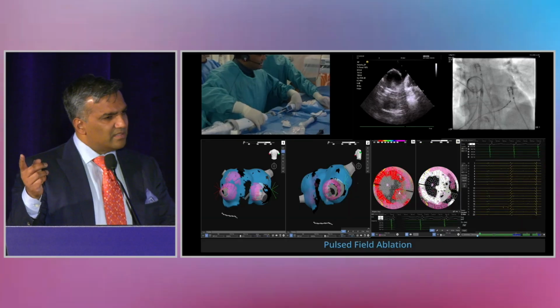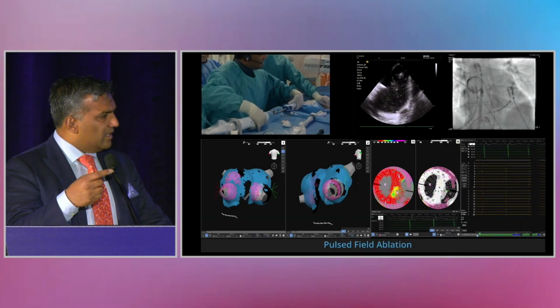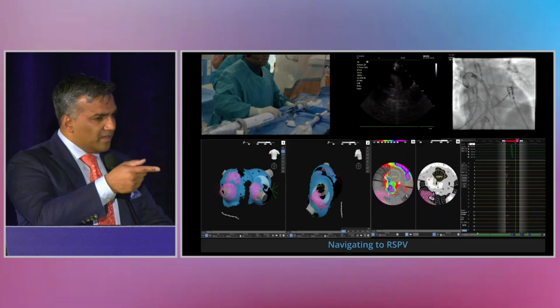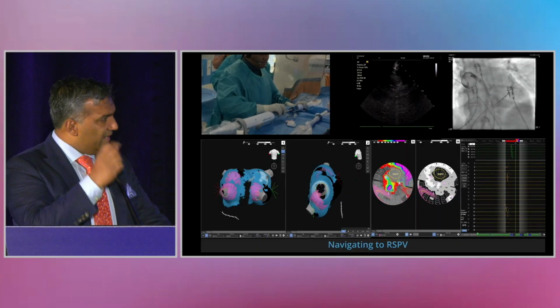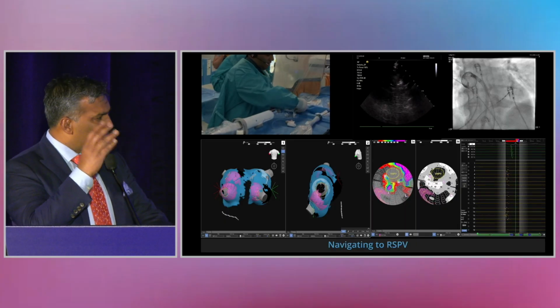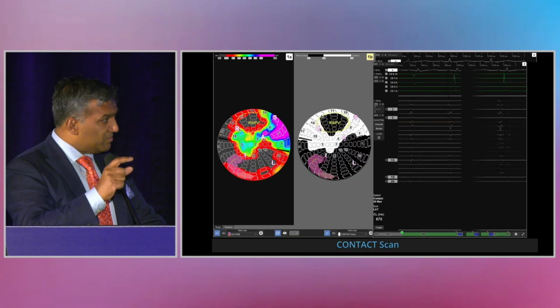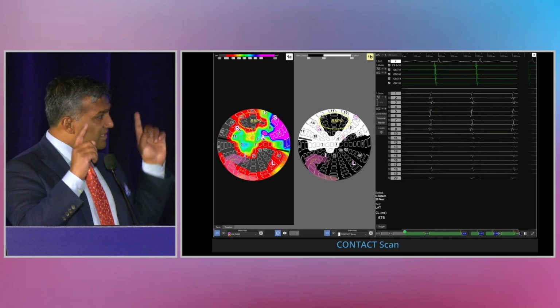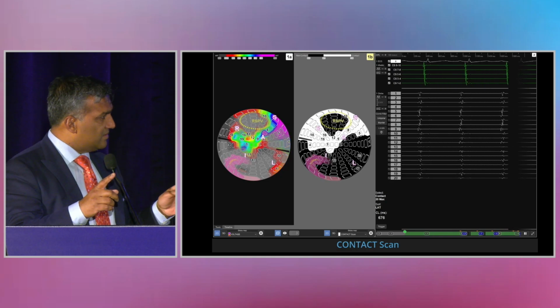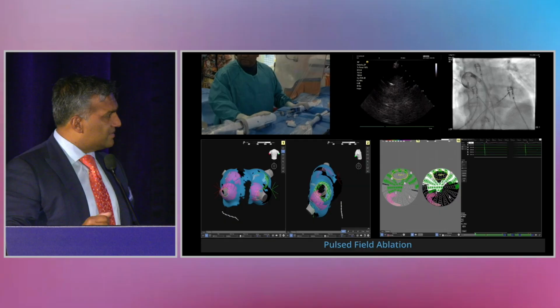I mean, we saw this in the first in human trials with Peter when we were doing remapping studies, certainly in the preclinical work. And even here, again, I want to just stress this. I'm going to make up the numbers, somewhere between 10 to 15 patients that came back for redo ablation procedures in the pivotal trial. So these are patients that had clinical recurrences, okay? And despite that, the PVI durability was like mid-90s.